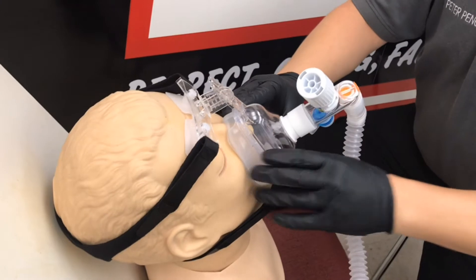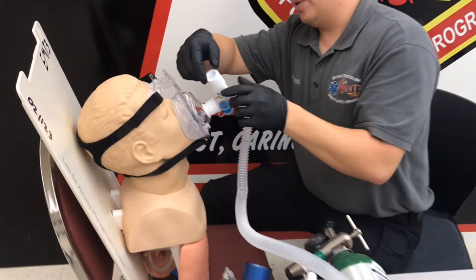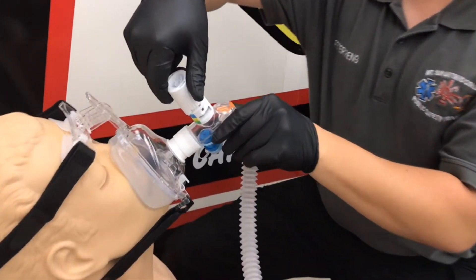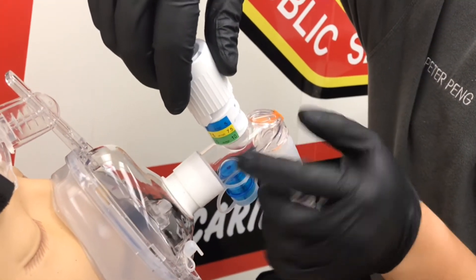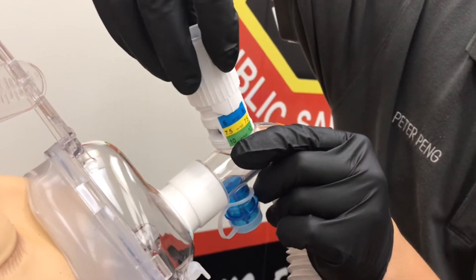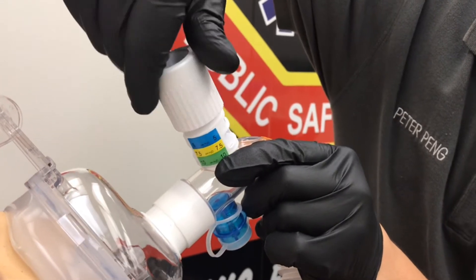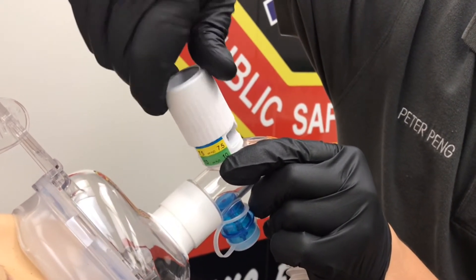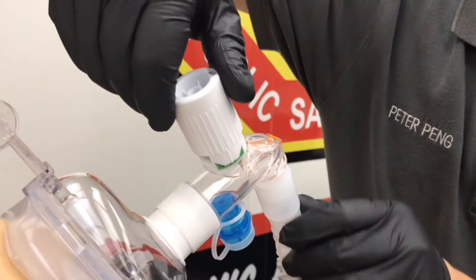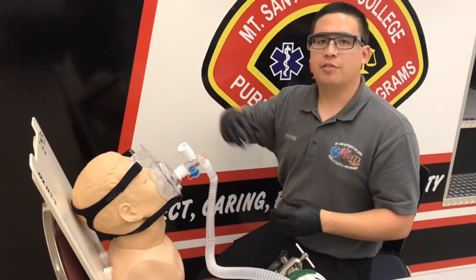Check with your patient to make sure they are able to tolerate this. Right now it's at the lowest setting, so we can turn this knob here. As we turn it you can see it goes to different levels of pressure — right now it's at five centimeters of water. Turn it once and that's 7.5, and all the way down is 10. Every time you change it, make sure you check with your patient to make sure they're comfortable and able to tolerate that amount.